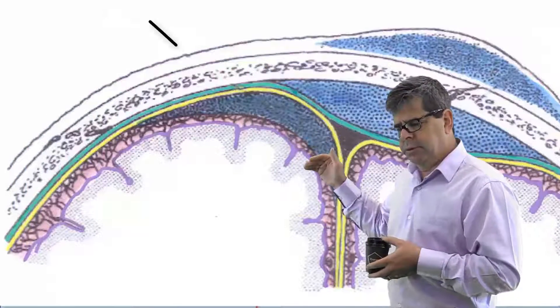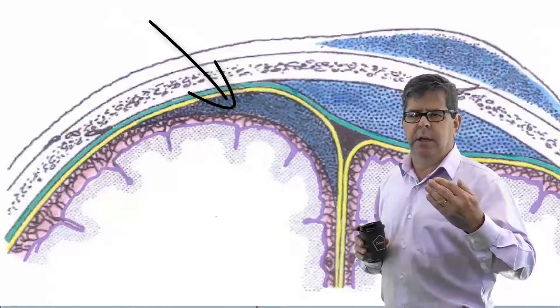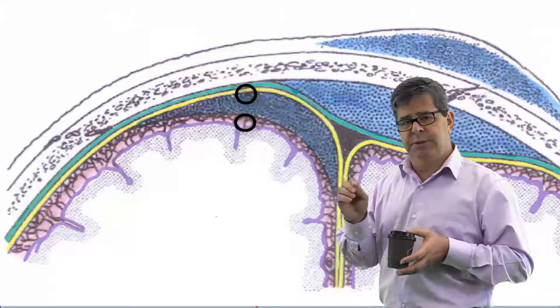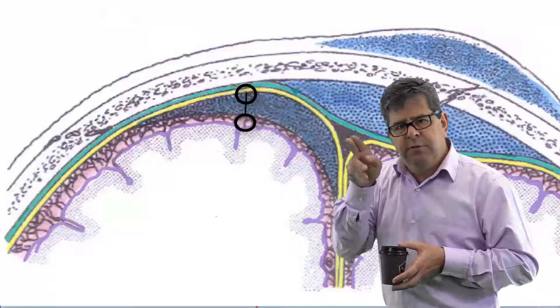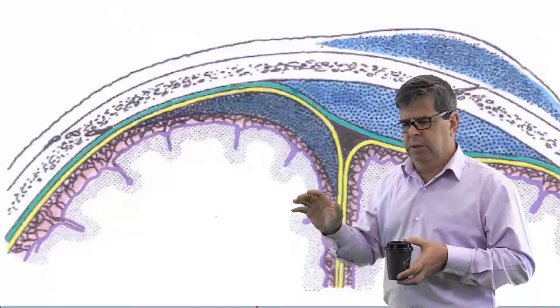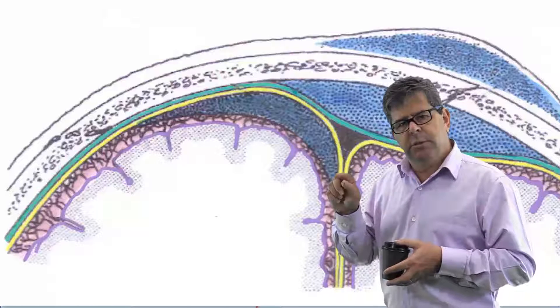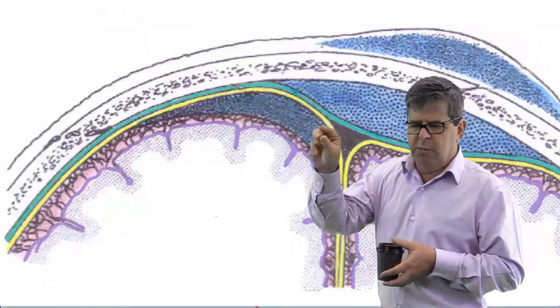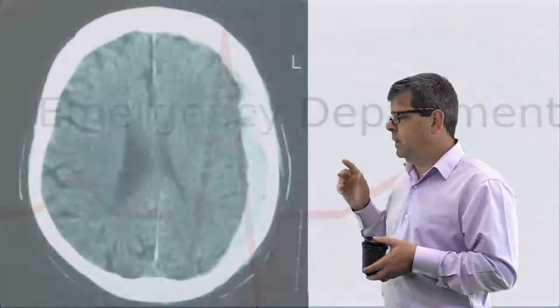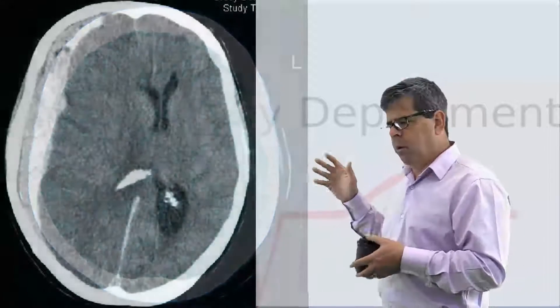Now we're going to go to the subdural space. The subdural space is from the inner or meningeal layer of the dura to the arachnoid mater — again a potential space, but with bridging veins going through it. These bridging veins can be injured by deceleration or direct injury, and they'll bleed. But they're not limited by the cranial sutures, so they can be quite long and continue along. You can see here some acute subdurals — they can be on one side or on both sides.